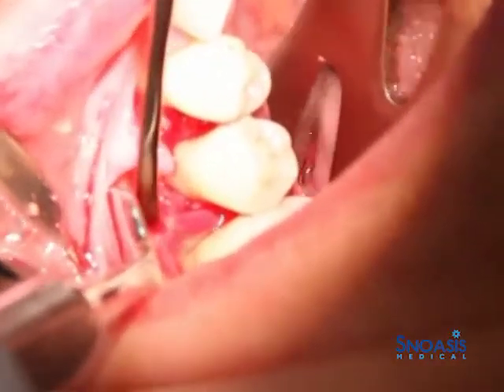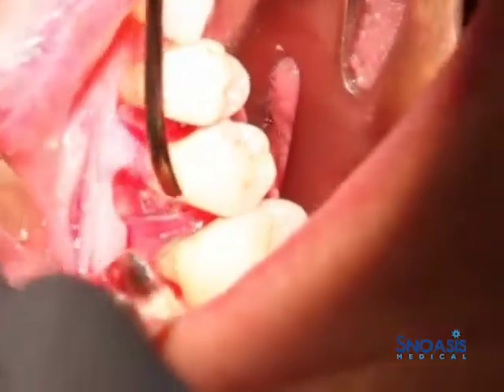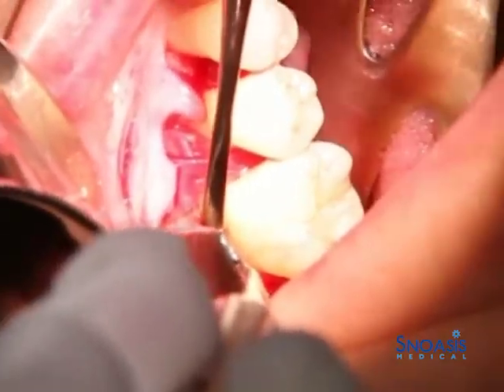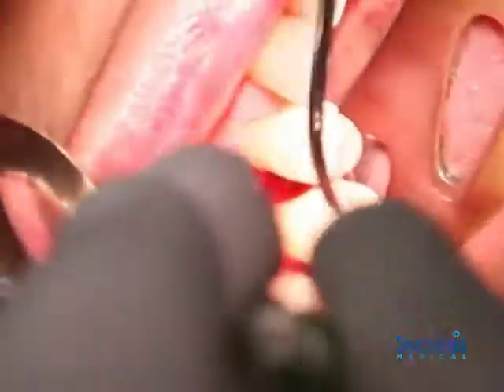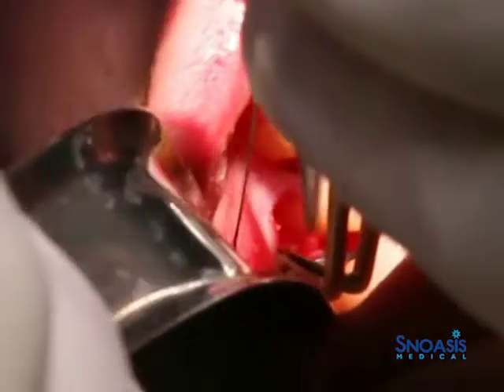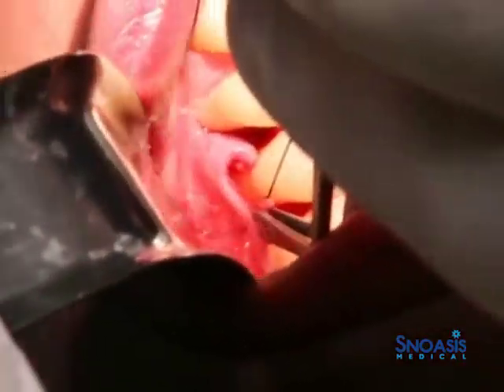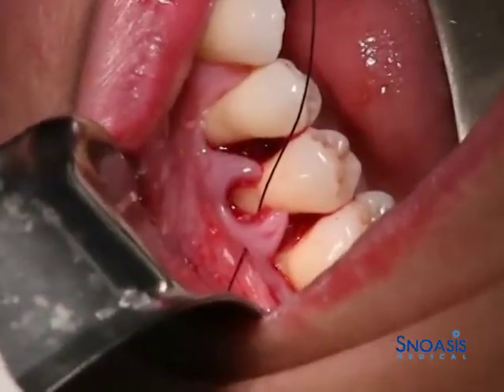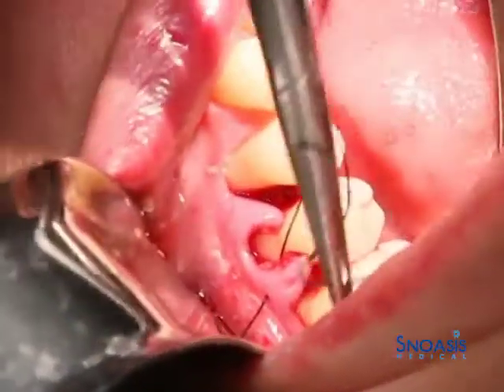We got one barrier here, one barrier here. You see them hydrating, and we're ready to suture. The one thing you just have to be careful with suturing is not to pick up the membrane. So the easiest way to do that is to go through backwards.